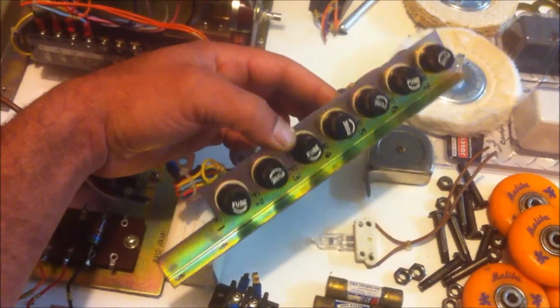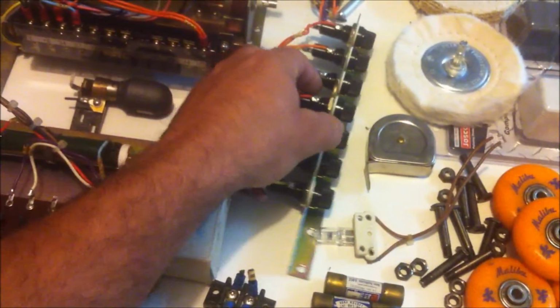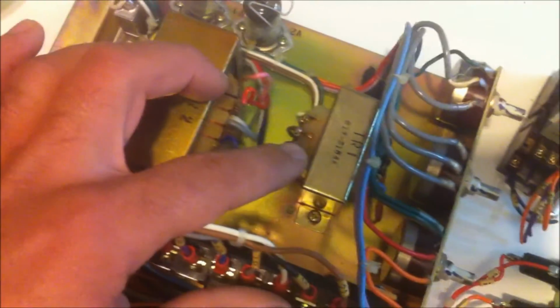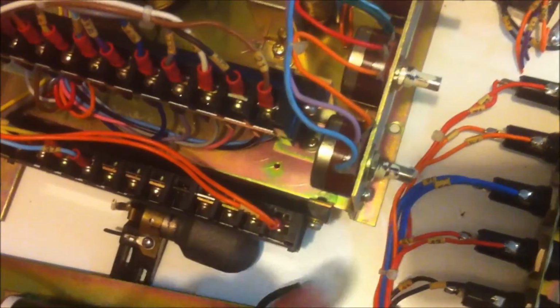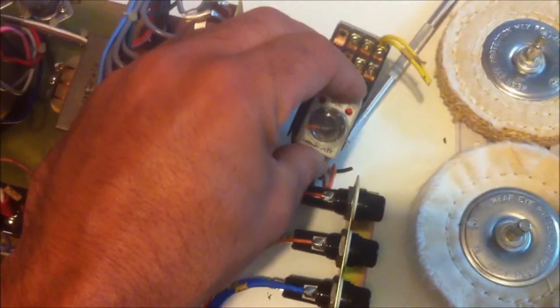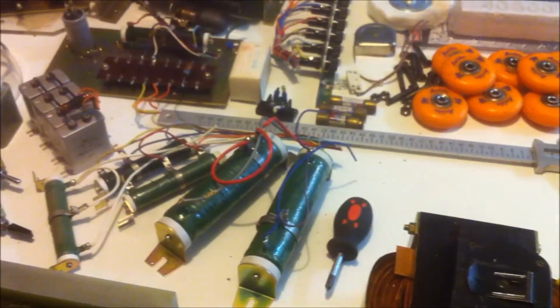I got this bank of panel mount fuses here, and on the back end of this, you can see some tubes there, capacitor, a couple of transformers here, and some potentiometers that have been preset and stuck into position. And I also got this little timer guy here. So that's pretty much everything that came out of the X-ray machine.